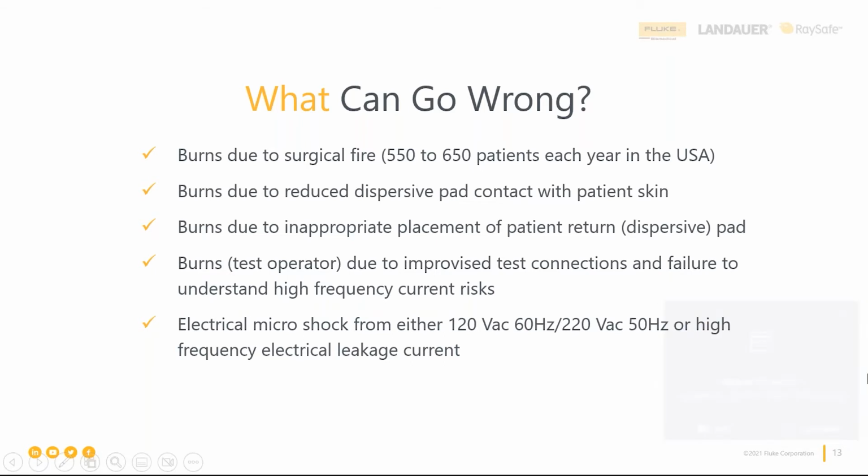And some of those carts are pretty heavy. So when you have those heavier carts, you really got to watch that they're not cutting through your power cords. So just something to keep in mind is looking at those power cords as they're laying across the floor. Make sure you get a good visual inspection on those, because that is one I saw a lot of.